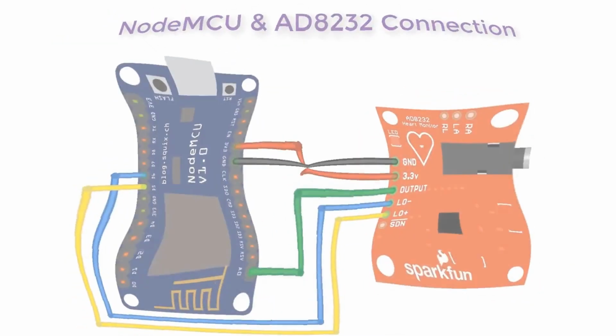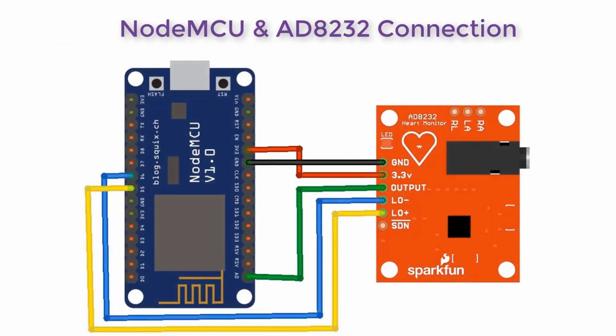Now let's begin with the circuit diagram first. So AD8232 has 6 pins. Out of them, SDN is not used. Connect the output pin to analog pin A0 of NodeMCU. Connect the LO plus and LO minus to D5 and D6. Similarly, connect 3.3V to 3.3V and ground to ground.